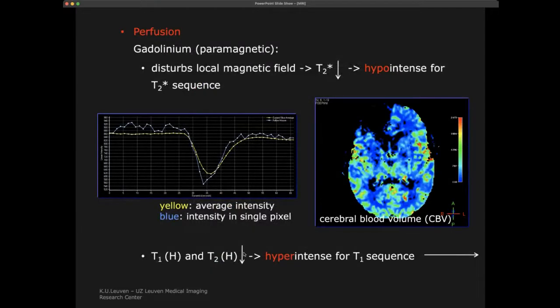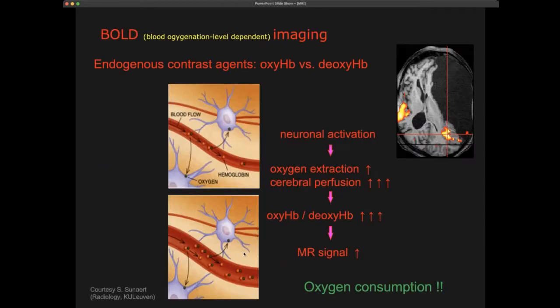We can also look at perfusion of the brain, so really look at blood flow within the brain in general. So really the amount of flow besides the vessels, also by looking, for example, at dynamics of contrast, for example gadolinium in this case. That's not that important. But another thing that we can do is called functional imaging, which predominantly works for neurology, and is actually based on the use of contrast agents of the own body.